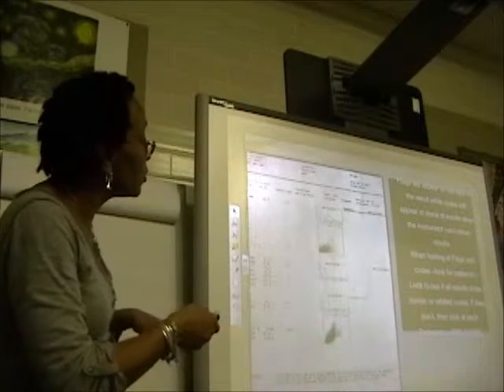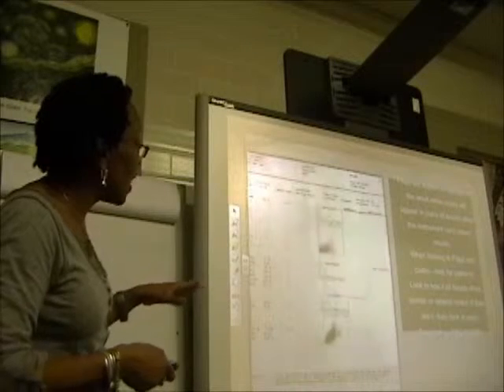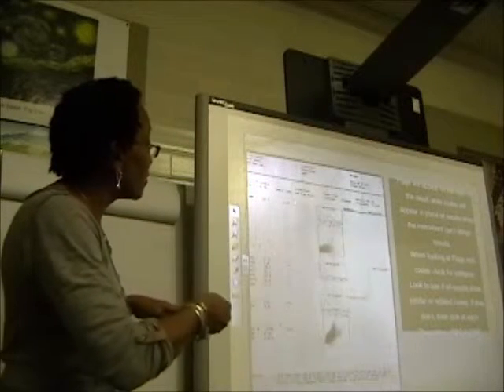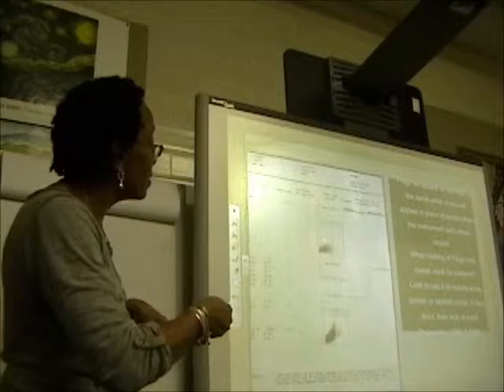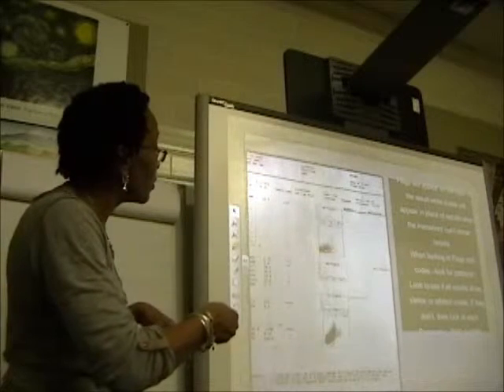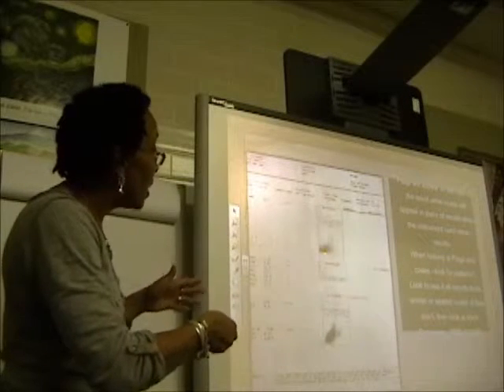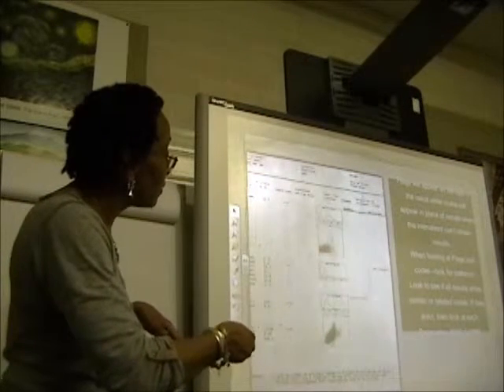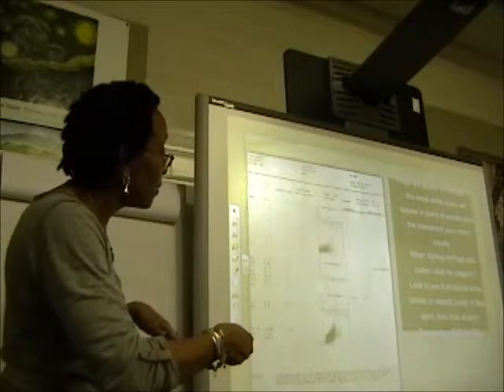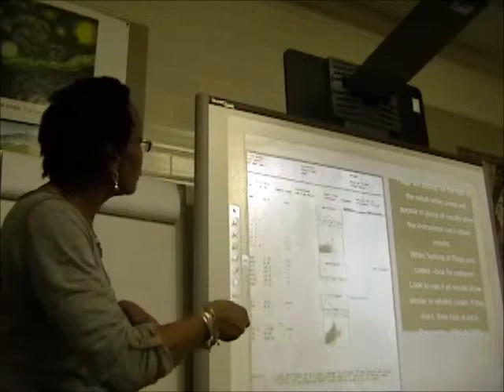So when you're looking at your flags, you want to make sure that everything is kind of in accord. So we've got this on the data plot. It's no separation of cells, okay? And it's down here where the platelet clumps or RBC fragments will be. And on the suspect flag, you've got the platelet clumps, okay? So you want to look and see what's jiving, okay?